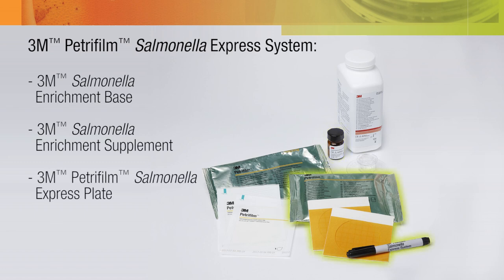3M PetriFilm Salmonella Express Plate, a sample ready-to-use chromogenic culture medium system that contains a cold water soluble gelling agent and is selective and differential for Salmonella, providing a presumptive result.